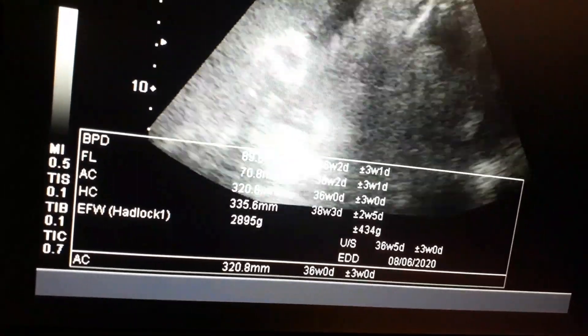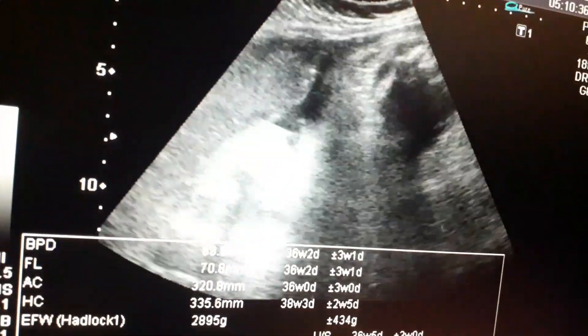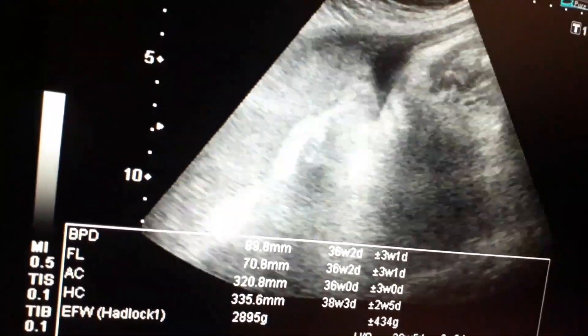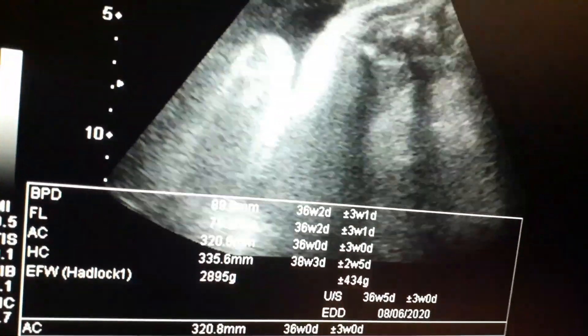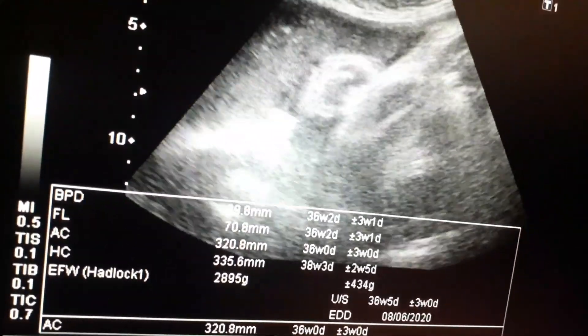This is the lower lobe of the placenta — you can appreciate it very well, a very nice view. The lower lobe of the placenta is reaching up to the mid-segment of the uterus, not going to the lower segment. Now I am going to focus the femoral bone to calculate the femoral length and also to appreciate the sex of the baby.